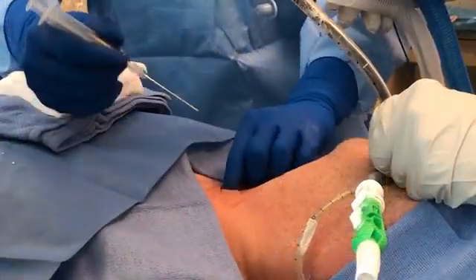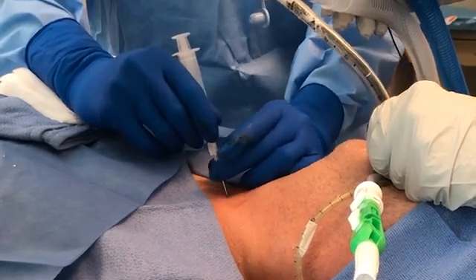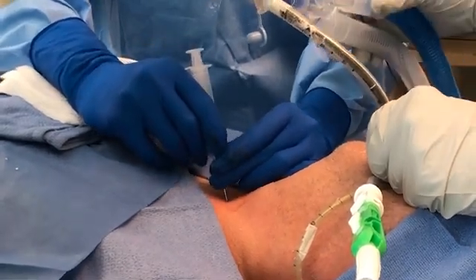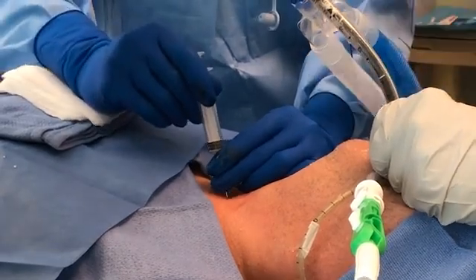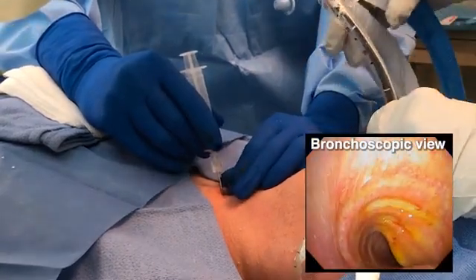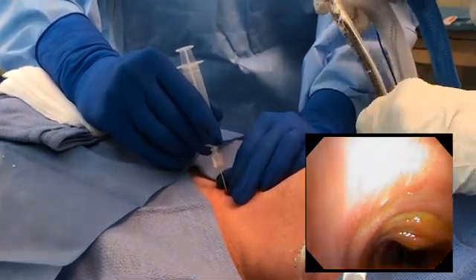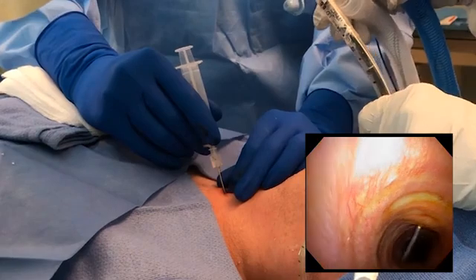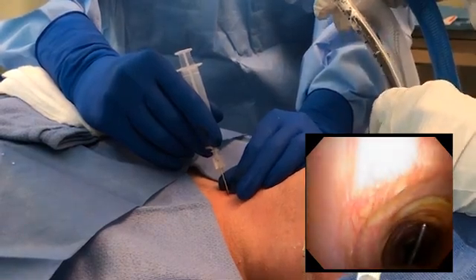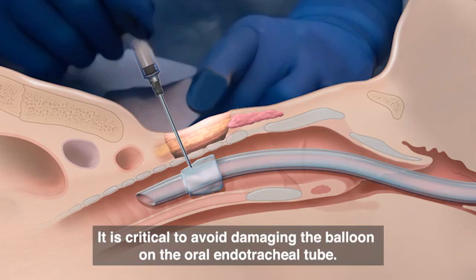Once the oral endotracheal tube has been withdrawn to an appropriate location, perform the tracheostomy using the Seldinger technique. Insert the introducer needle through the anterior wall of the trachea under direct bronchoscopic visualization. The needle should be inserted at approximately the level of the second tracheal ring, perpendicular to the trachea with the bevel facing down. Placement of the needle bevel in this downward position will help to direct the guide wire into the distal trachea. It is critical to avoid damaging the balloon on the oral endotracheal tube.